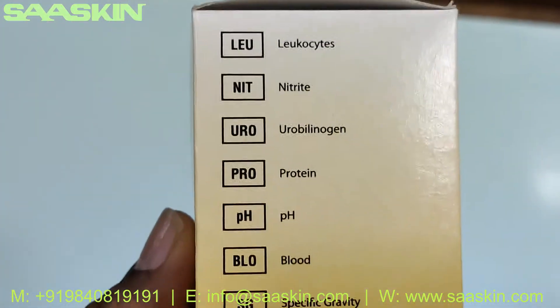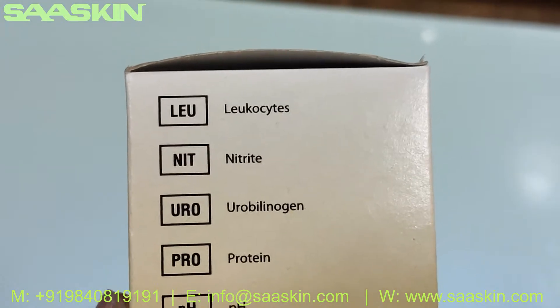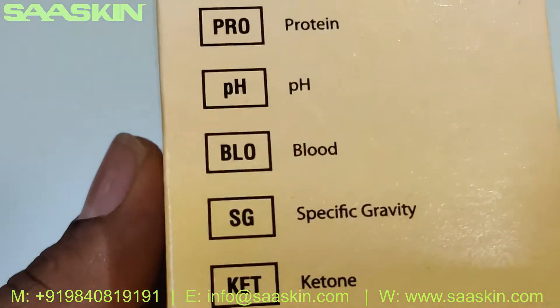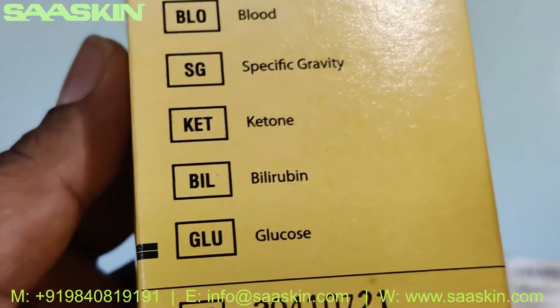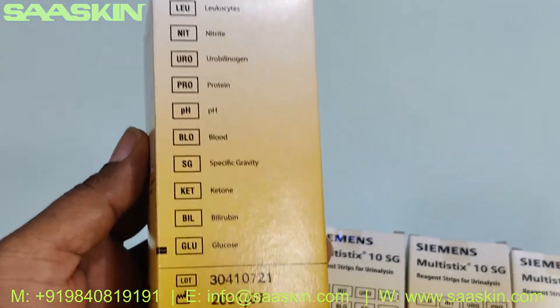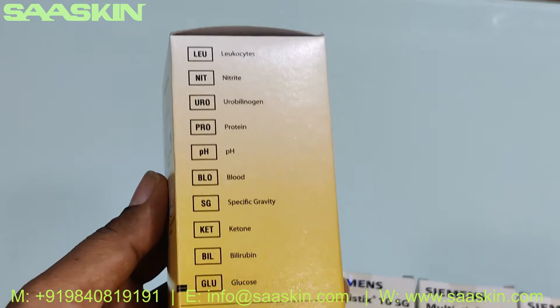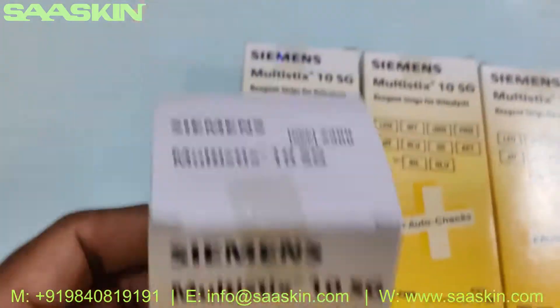These are the different tests you can conduct using these strips. It's leukocytes, nitrite, urobilinogen, protein, pH, blood, specific gravity, ketone, bilirubin, and glucose. You can see how many tests you can conduct — one, two, three, four, five, six, seven, eight, nine, ten — about ten tests can be conducted using this strip.